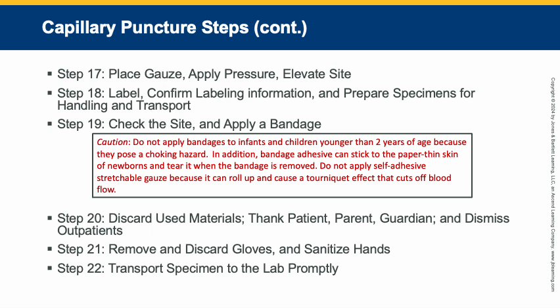Step 17. Place gauze, apply pressure, and elevate the site. After collecting the specimens, apply pressure to the site with a clean gauze pad until bleeding stops. Keep the site elevated while applying pressure. Elevate an infant's foot above the body while pressure is applied.